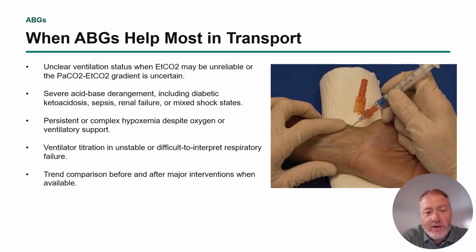So if you have any kind of unclear ventilation status, when the end tidal maybe is unreliable, or the gradient between the PaCO2 and the end tidal is kind of wonky, like if you're looking at a patient who looks like they are going down, hypoventilating, with shallow breathing, and their end tidal is reading 25 and not moving, chances are that end tidal is not an accurate representation of their actual PaCO2.